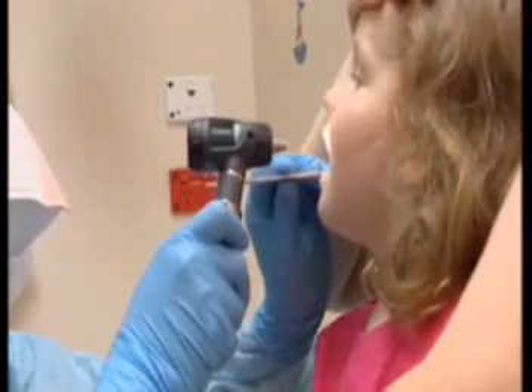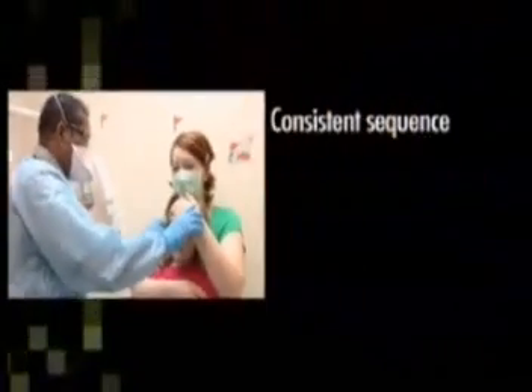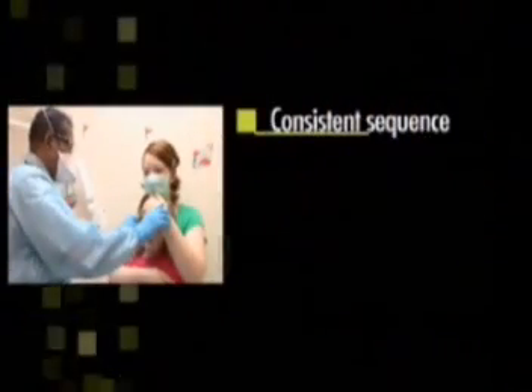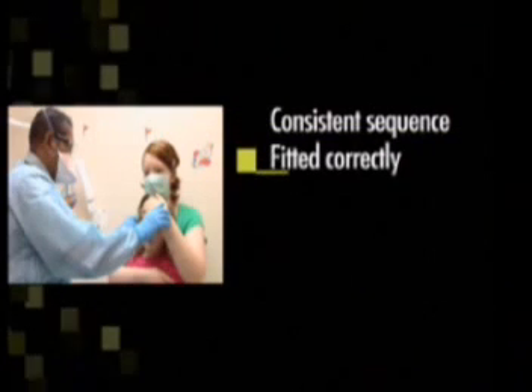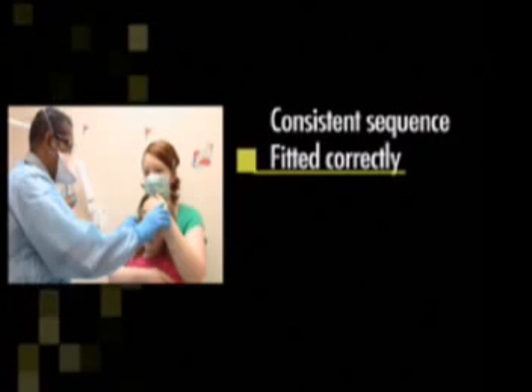Key principles to be considered when putting on your PPE include: having a consistent sequence so that this can become routine, and ensuring your equipment is correctly fitted to provide maximum protection.